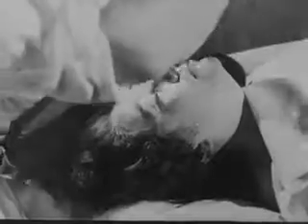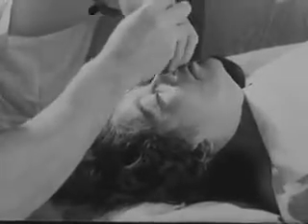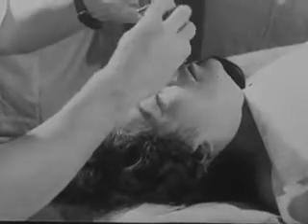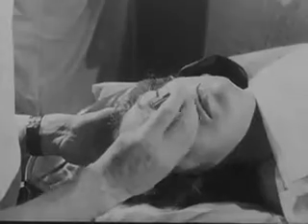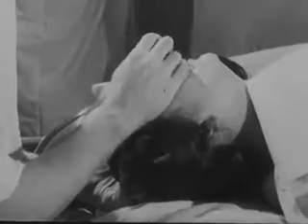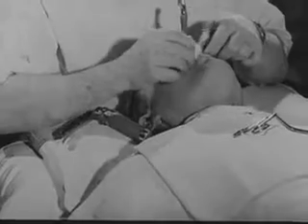If the tube does not go in readily by the blind method, the anaesthetist should on no account continue prodding. Inexpert intubation and the use of force instead of skill are likely to result in trauma. This is a potential disadvantage of endotracheal anesthesia, but it is avoidable. In a difficult case, the anaesthetist should resort to the laryngoscope and forceps.